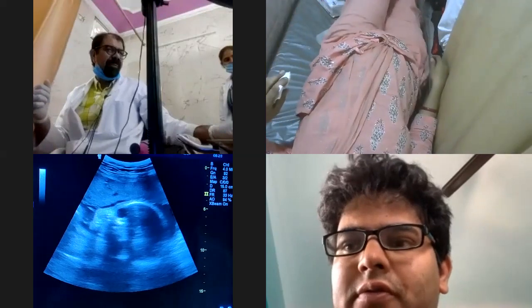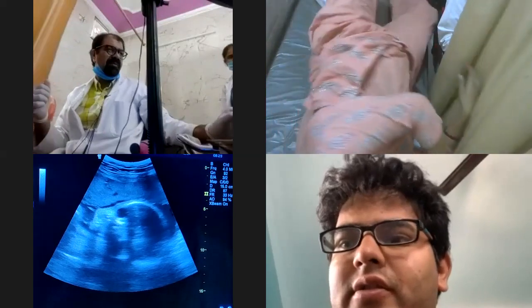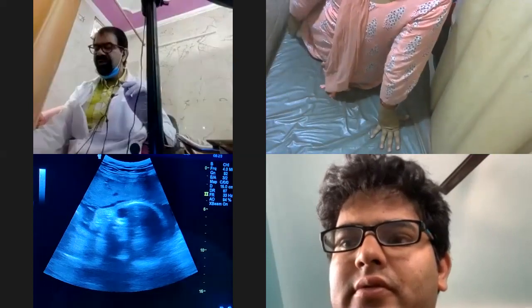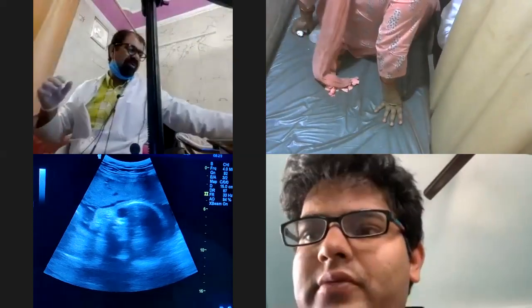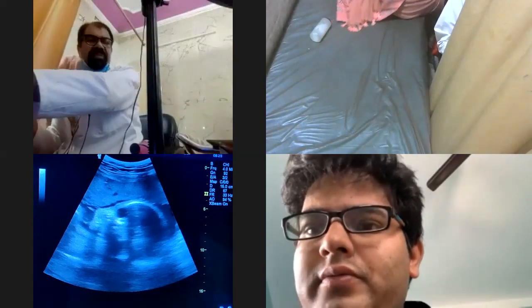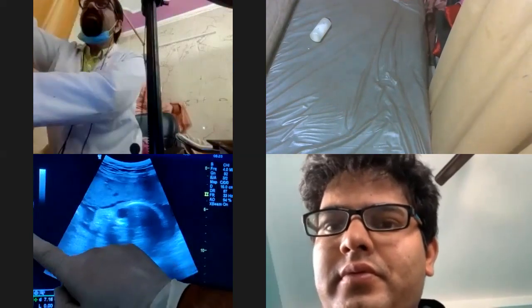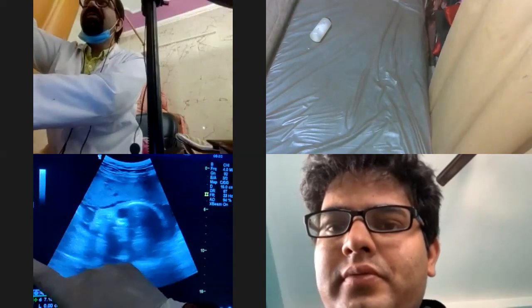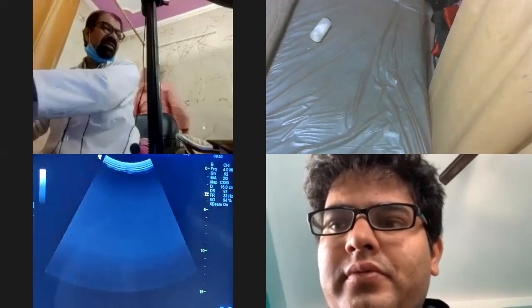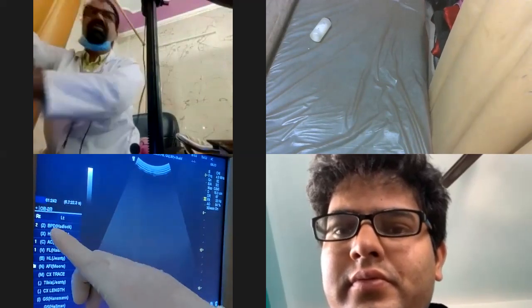Sir, how to calculate fetal weight, sir? Fetal weight. Now see, for fetal weight, what I have to do, I have to give the head perimetry, HC, BPD, femur length, and abdominal circumference. This is here. BPD, HC, AC, femoral length. Then I have to go to the worksheet. And the machine is automatically giving me, now see, this is the thing what I will show you.